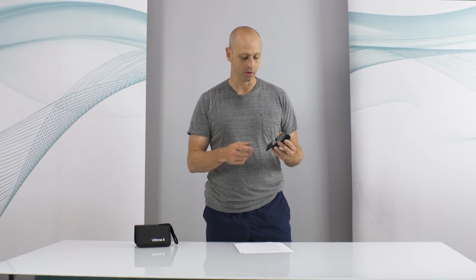So your three modes are burst, normal, and modulation. On other devices or more advanced devices, you can see subsets of those. So you can see a burst 1, a burst 2, or a modulation 2, a modulation 3. Those are your modes, and that is how you set those.